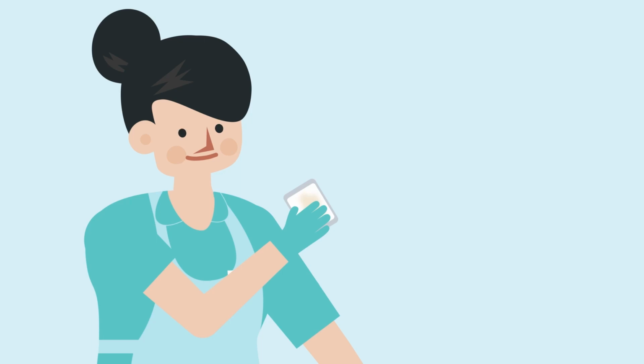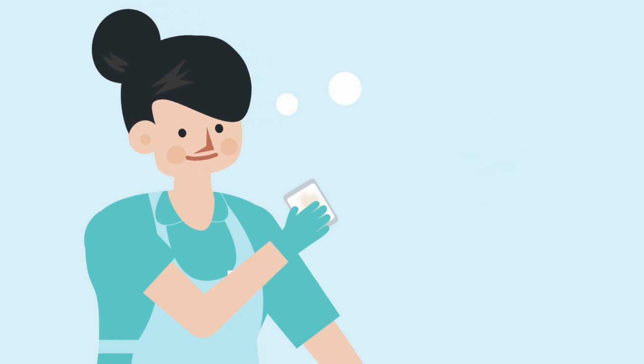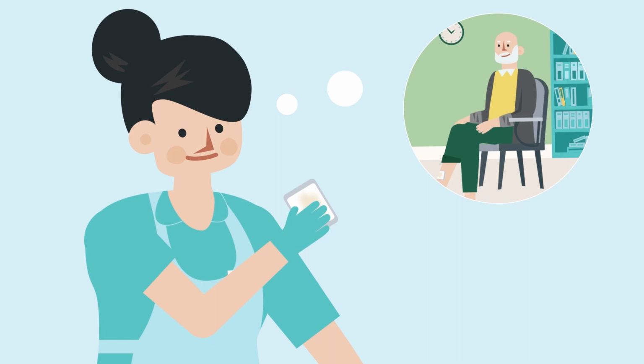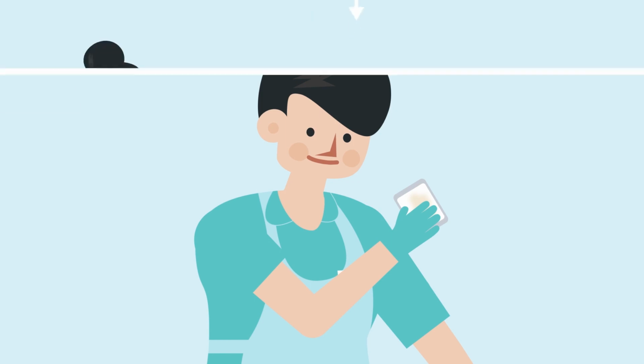Choosing an appropriate dressing is an important part of wound management. But how do you know if you're making the right decision? This depends on the status of the wound, your patients, and the environment around the patient. Also, how often you need to change a dressing plays a role here.